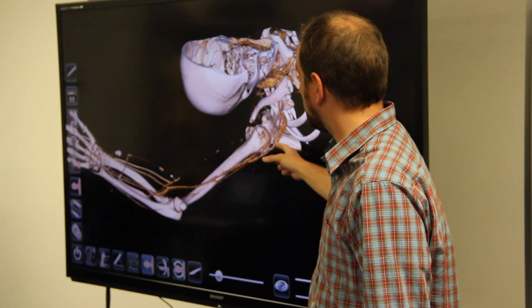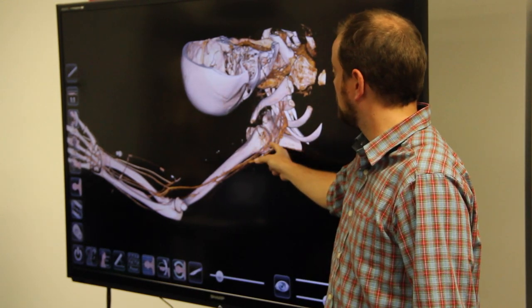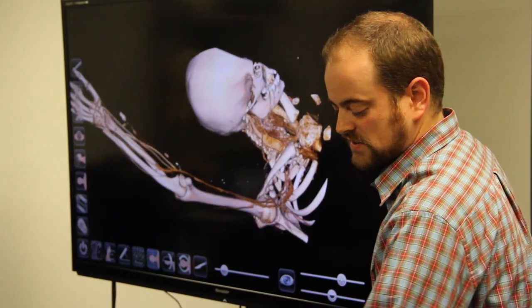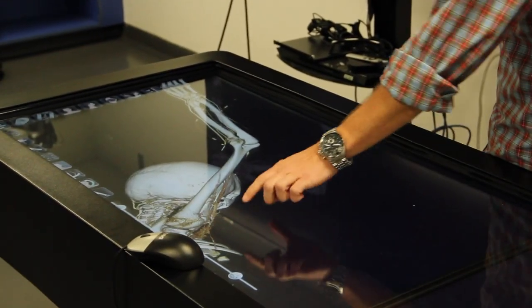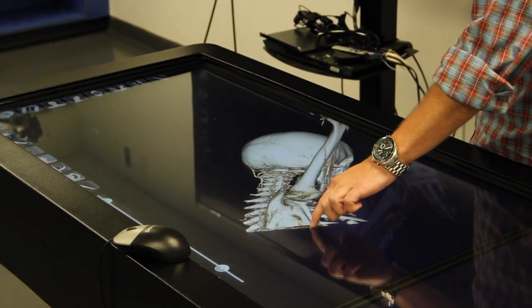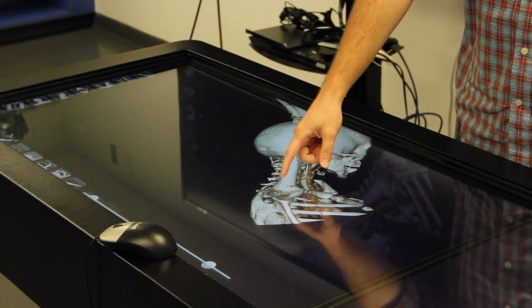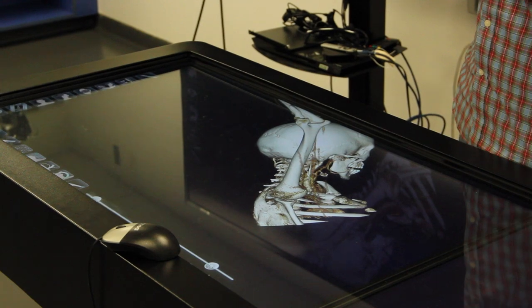So the coracoid process, this would be the glenoid fossa. Here's the head of the humerus. So we now can see that glenohumeral joint allows for a lot of motion. When the actual humerus starts to hit the acromion, that's what's going to limit that motion.